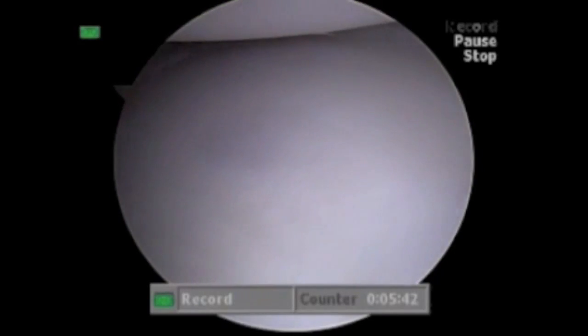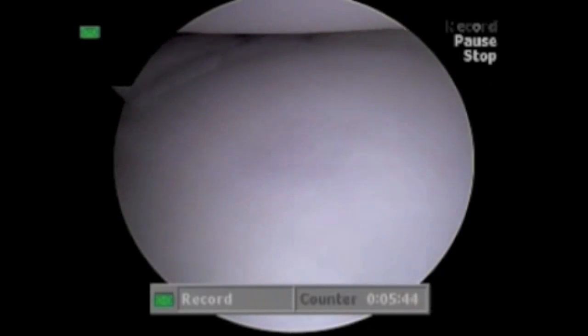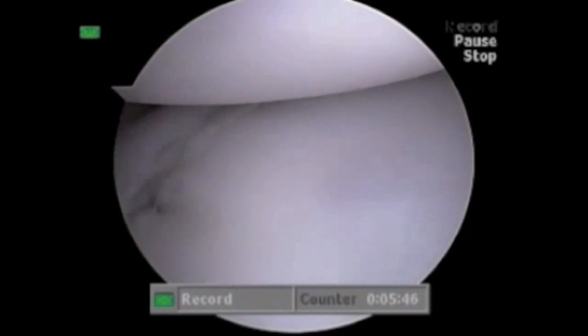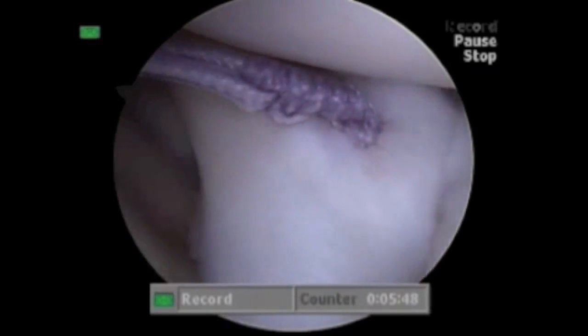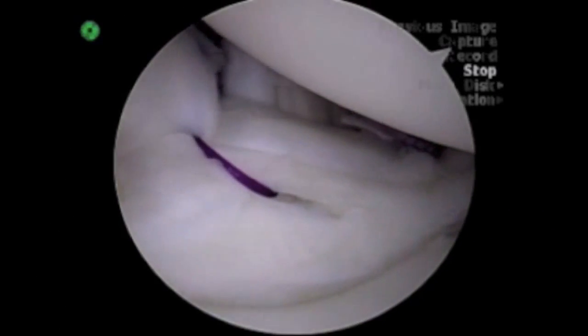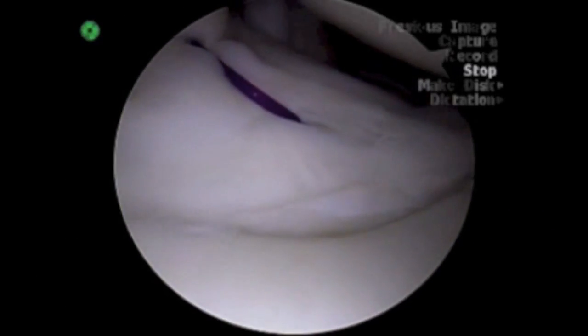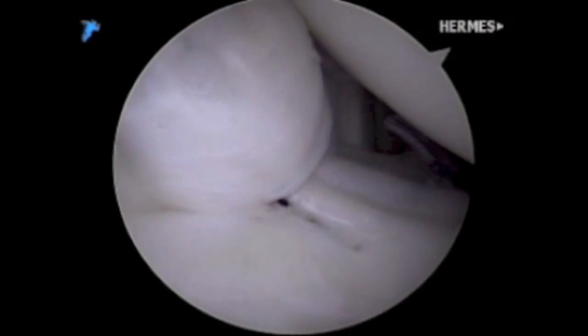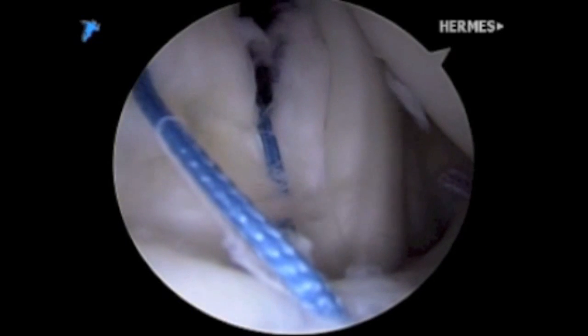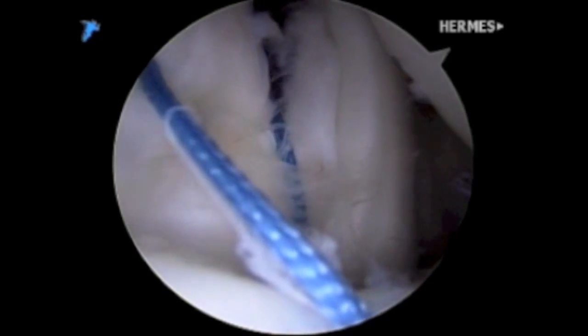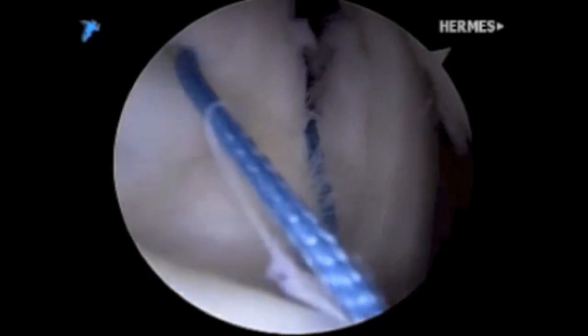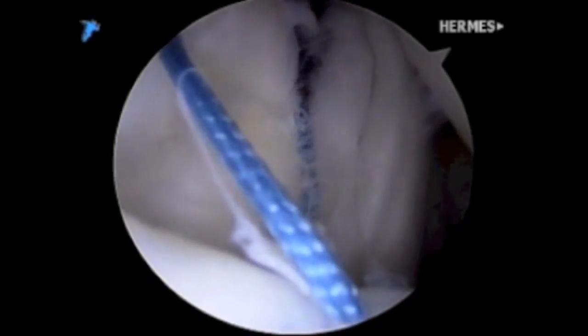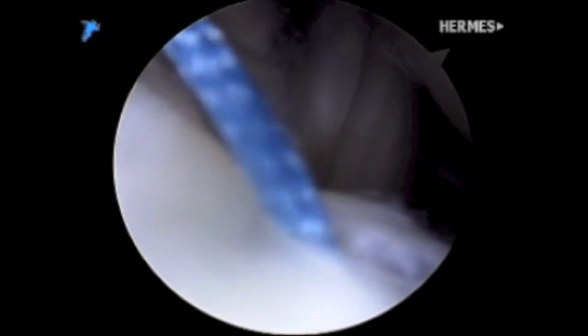Absorbable sutures can be utilized at this juncture with an effort to decrease the drive-through sign by at least 50% to 75%. Interval closure is recommended. The coracohumeral ligament, as part of the leading edge of the supraspinatus, should be captured with the closure. Using the PDS suture, a permanent suture can be shuttled through the rotator interval and the interval shortened, providing additional stability.